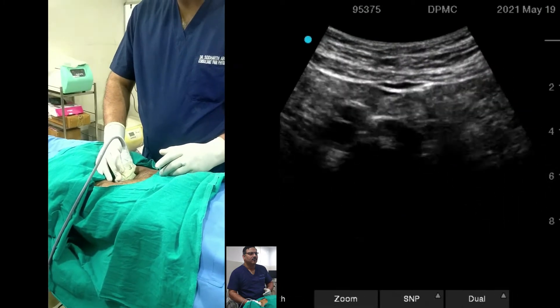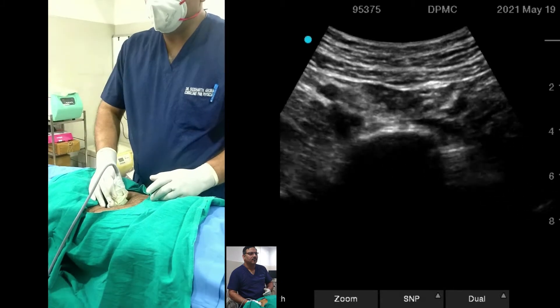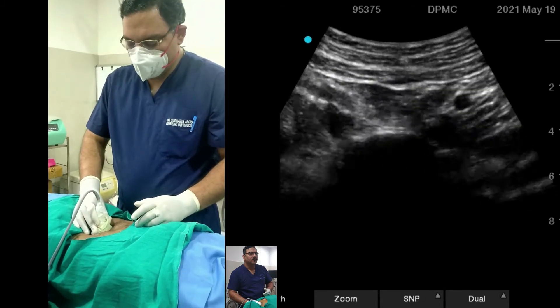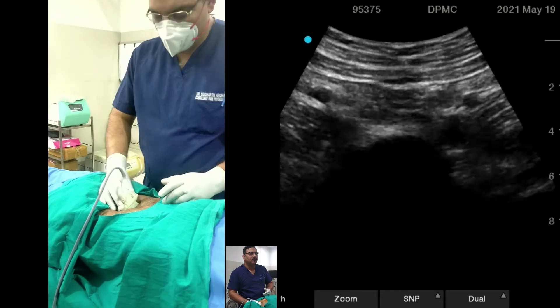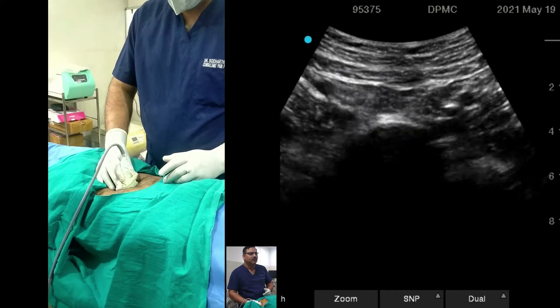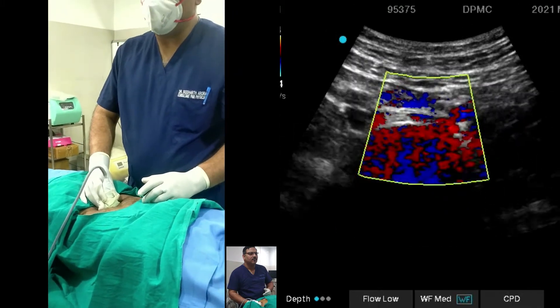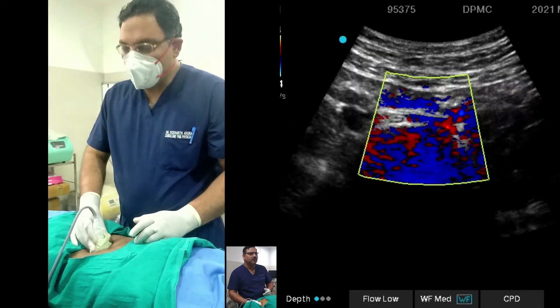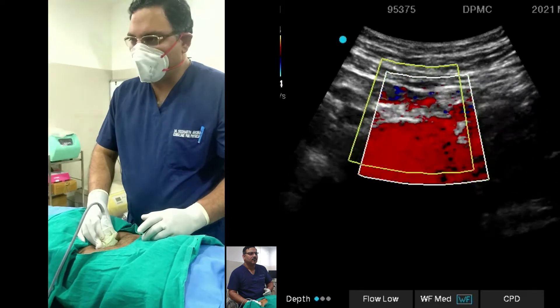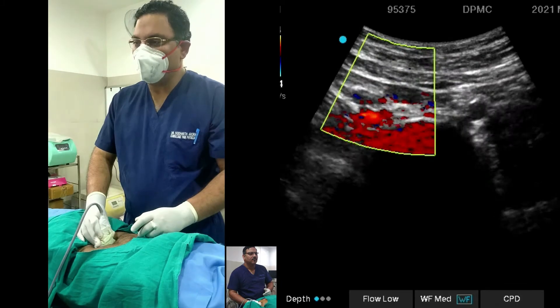Our main aim is to see the bone and cartilage, and on both sides of the bone and cartilage there will be the iliac vessels — right and left iliac vessels. As I am seeing here, the iliac vessels are nicely visible. After that, you can do the color Doppler to confirm whether it is a vessel or not.